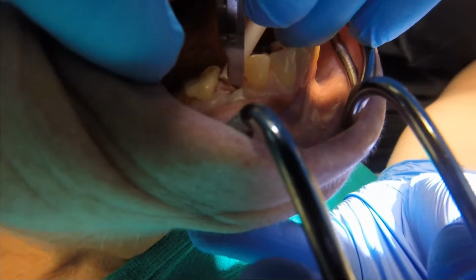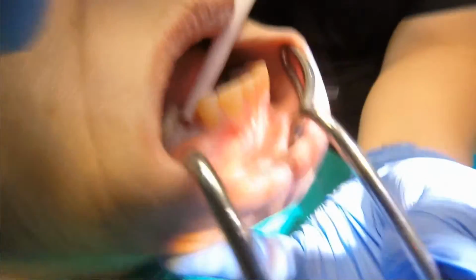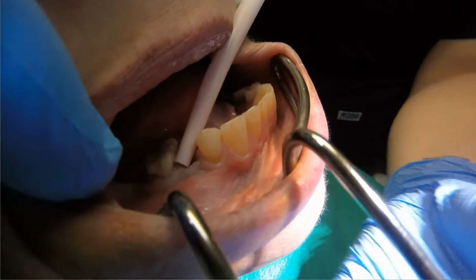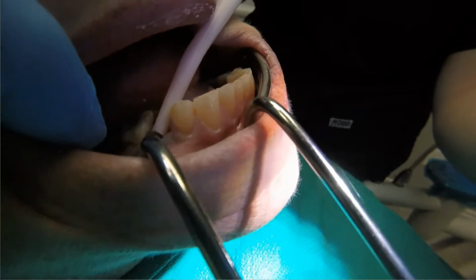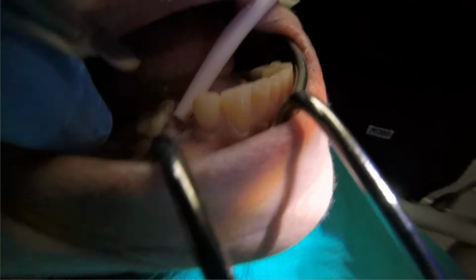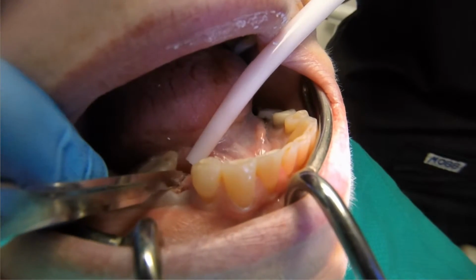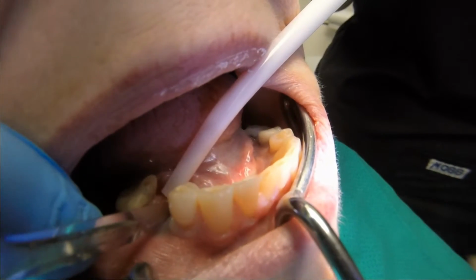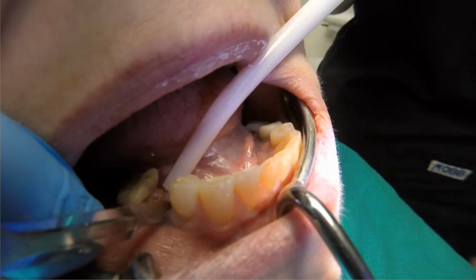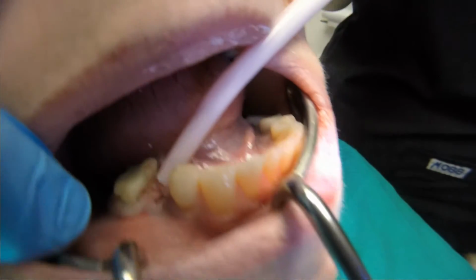And what the trap door does is it basically allows you to preserve as much keratinized tissue around the healing abutment as possible. And as we've discussed in many of the implant lectures, having good, healthy, stable, firm keratinized tissue around the implant is what is desired in order to prevent long-term problems that can be associated with things like peri-implant mucositis and peri-implantitis. So what we're doing here is we're basically making that trapdoor incision.